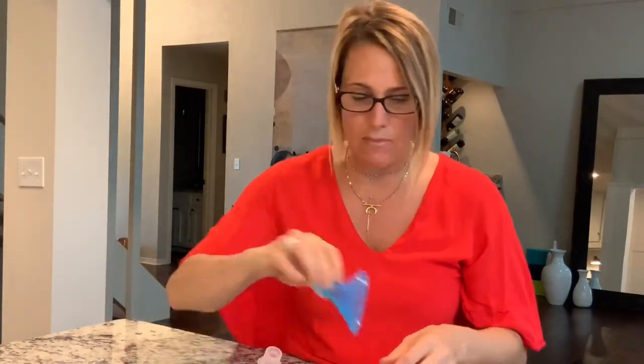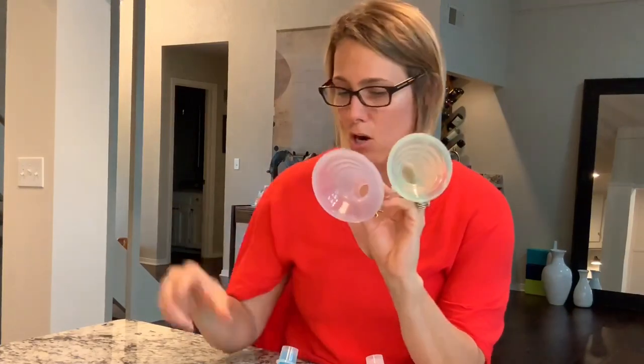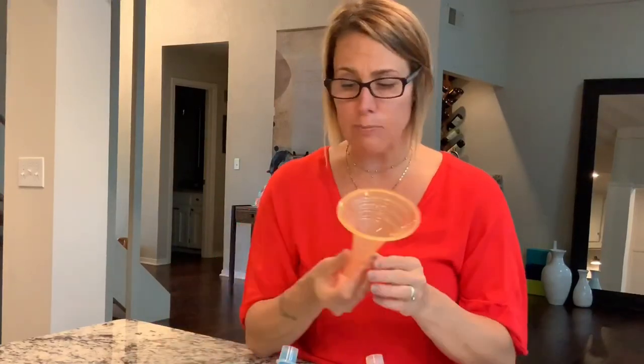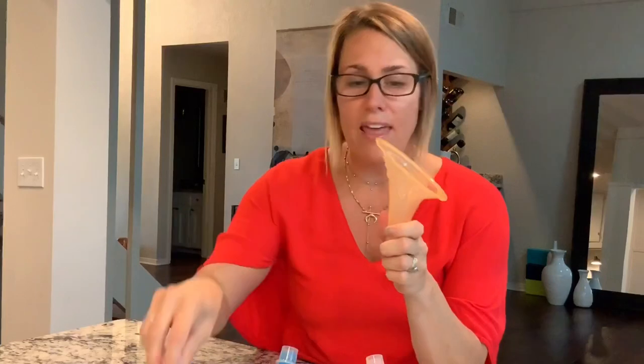Pumping Pals names their sizes extra small, small, medium, large, and extra large, and they go by color. These are soft silicone. The key difference between Pumping Pals and Medela flanges is the angling. For some moms, the sharper angle of a Medela is uncomfortable, and they might need the more gradual angle that Pumping Pal offers.